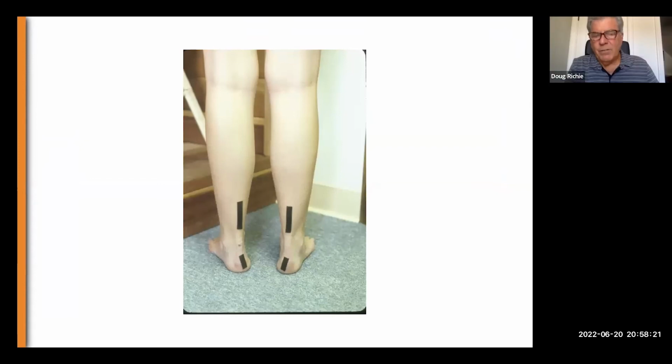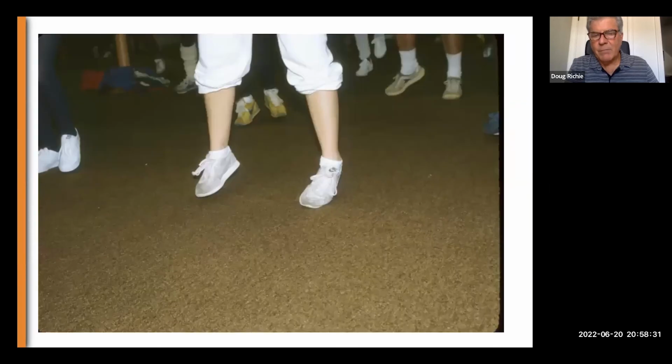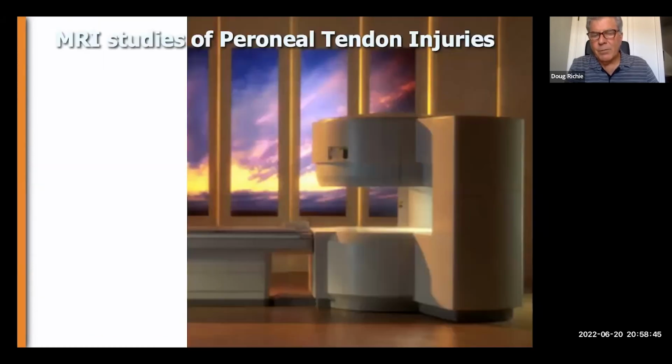So we can use a Richie brace to try to simultaneously balance the forefoot to the rear foot, evert the calcaneus, and then control inversion of the entire ankle joint complex, particularly when the heel comes off the ground. At this point, the foot orthotic is ineffective, but a Richie brace with continued contact all the way to the leg can continue to control the foot and ankle during terminal stance.